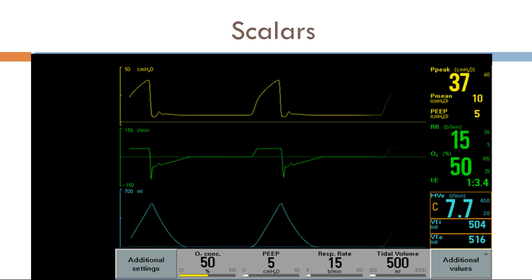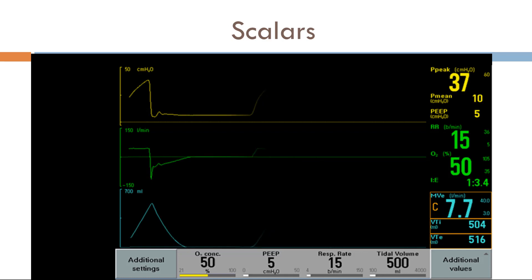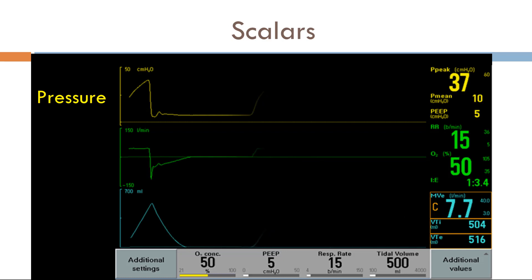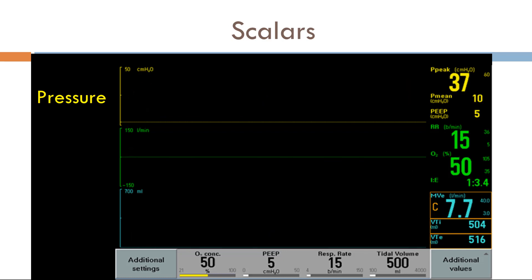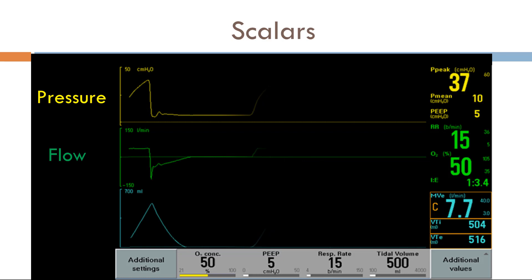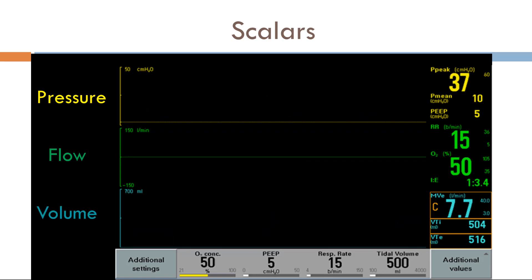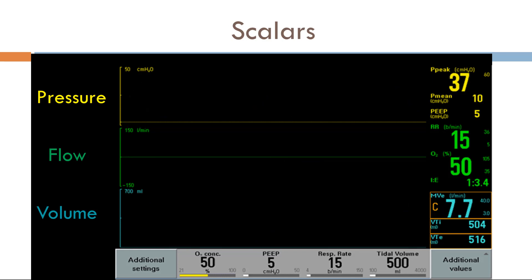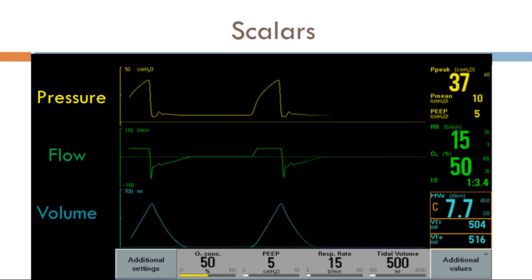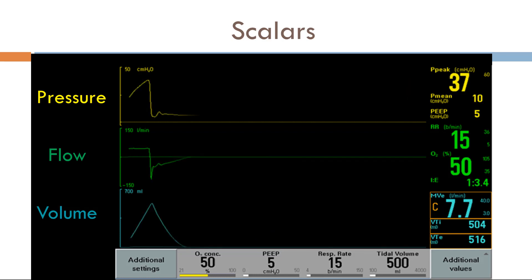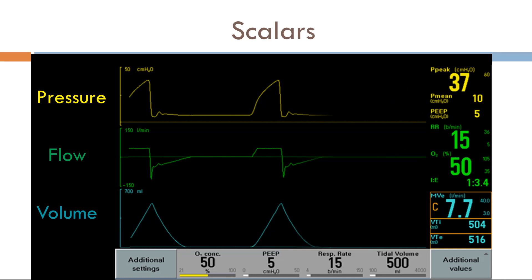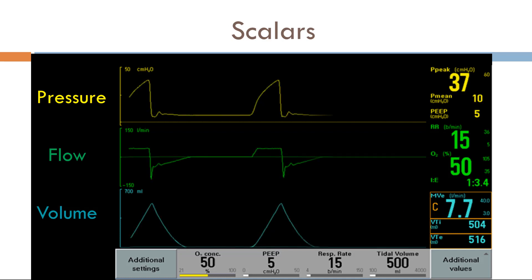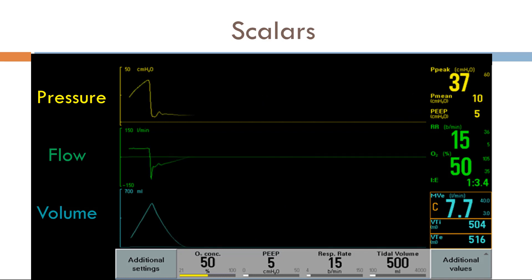The first things we see are scalars. A typical mechanical ventilator displays several waveforms. The first is a pressure-time scalar or pressure scalar. The second is a flow-time scalar or flow scalar. The last is a volume-time scalar or volume scalar. These are not loops — loops are something different, and we'll get to those later. Reading these scalars can be overwhelming at first, but just as there's a systematic way to read chest X-rays, EKGs, and ultrasonography, mechanical ventilation is no different.